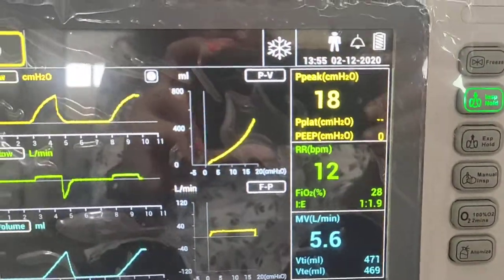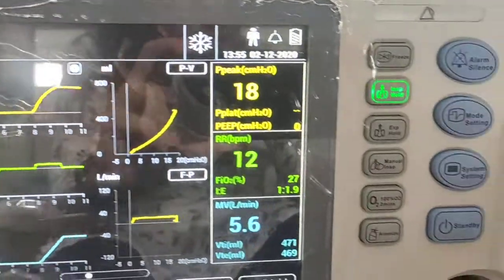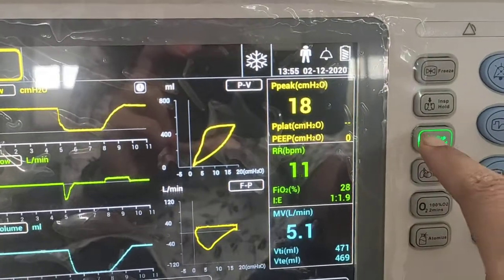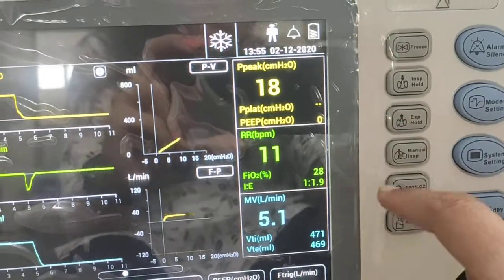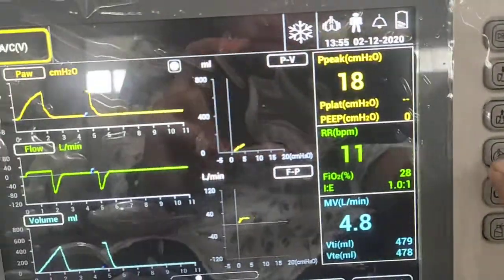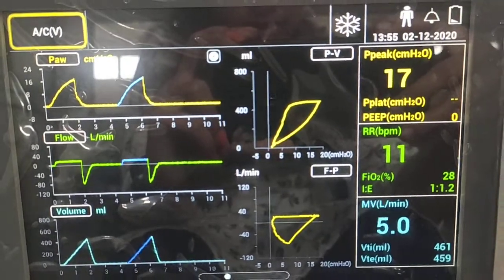Inspiration hold and expiration hold buttons are provided. When using inspiration hold, the inspiratory phase will be held for 30 seconds. The same applies to expiration hold. After that, the manual breath button is used to give manual breaths, which will be indicated in blue color on the waveform.